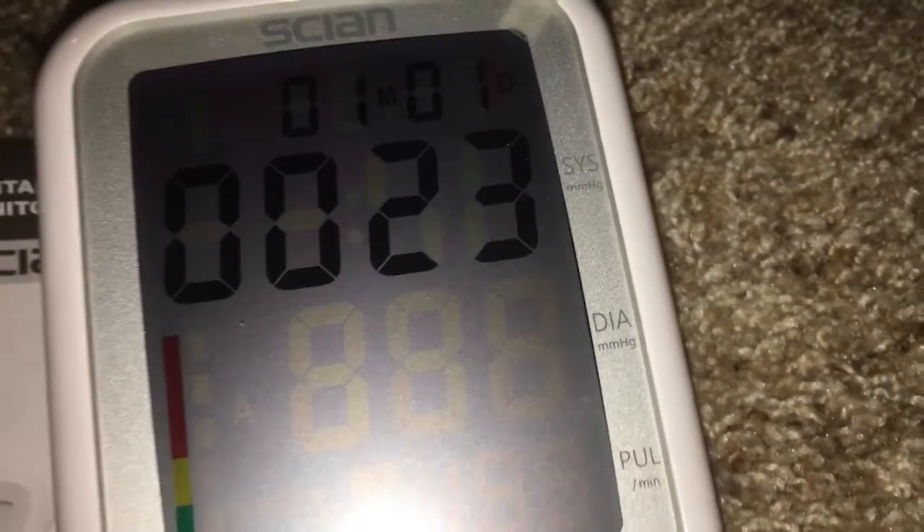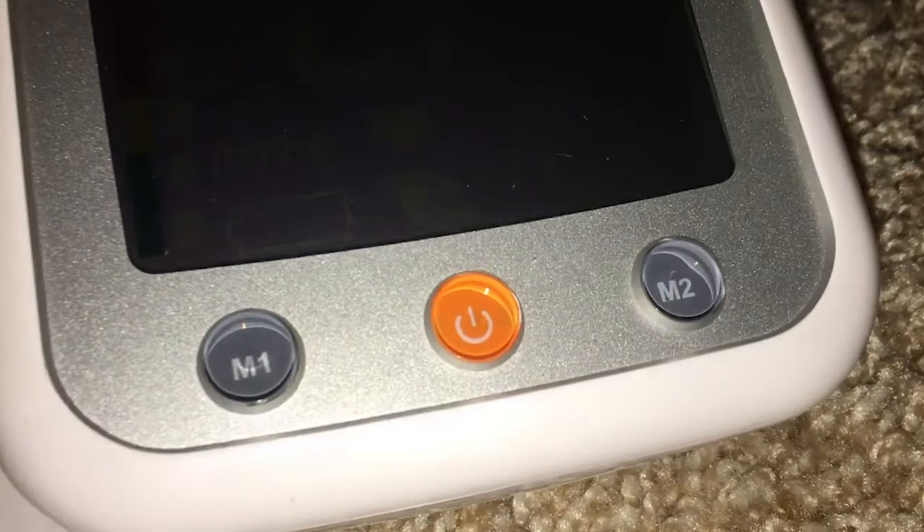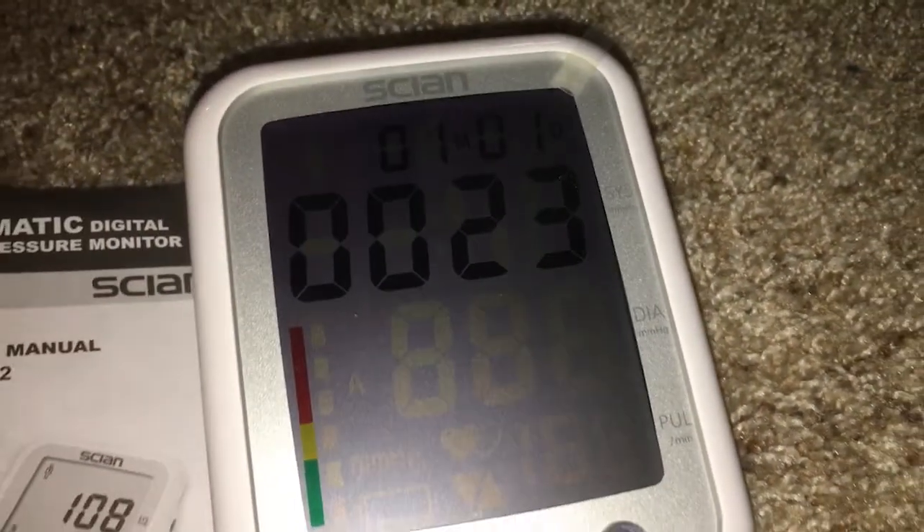Setting it up is simple. All you have to do is plug in four AA batteries, and then you hold the power button for two seconds. Hold the power button for two more seconds, and then it starts the readout process. After that, you'll get the results.